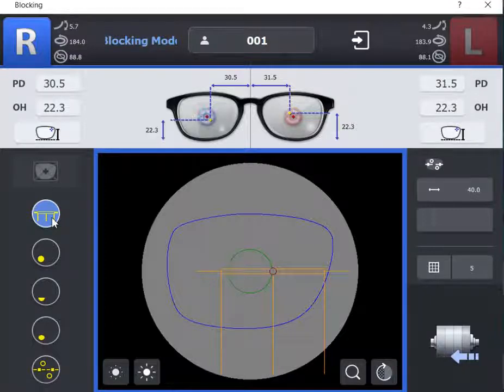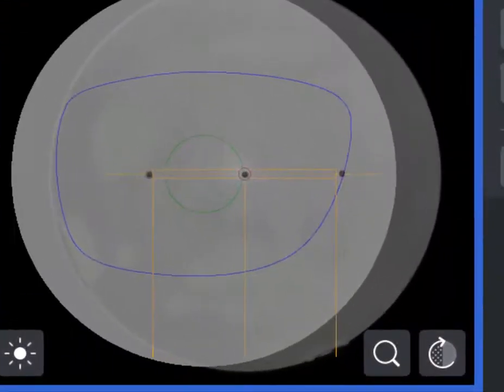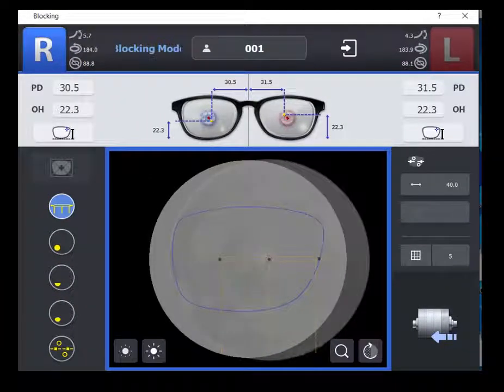Use your lensmeter to properly spot the single vision lens according to the prescription. Place the spotted lens on the standard blocking plate. Use the displayed graph to align the optical center and axis points. Ensure the optical center spot is centered in the small circle and axis dots are in the rectangular image. Once the lens is properly aligned, use the lever to place the block on the lens.